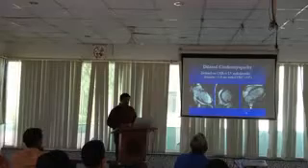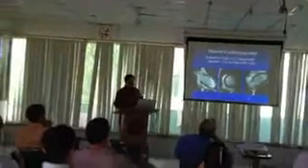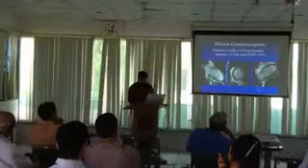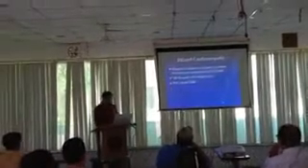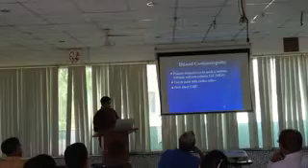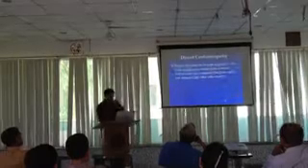What is dilated cardiomyopathy? Ejection fraction less than 45% and LV diastolic dimension more than 58 millimeters. These are the two criteria based on which you call whether this is dilated cardiomyopathy. There can be different types, whether toxin, peripartum, high output or HIV associated. The primary differentiation you have to make is whether this is ischemic or non-ischemic. You can obviously do an angiogram, but how can MRI help? This is what we will see.